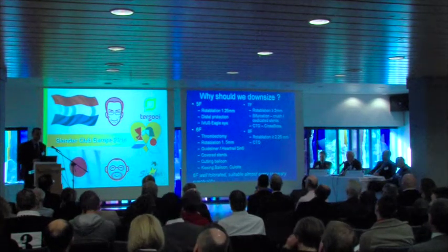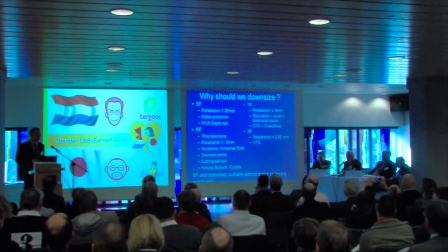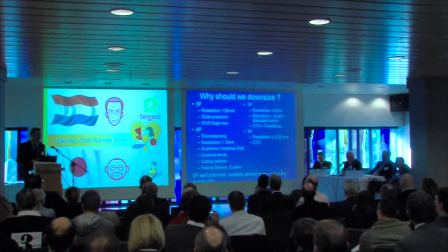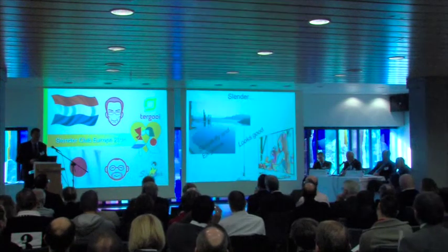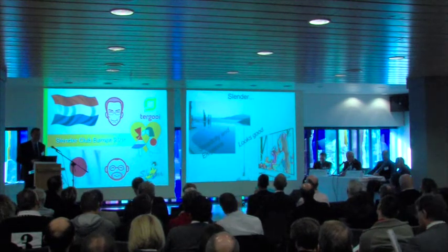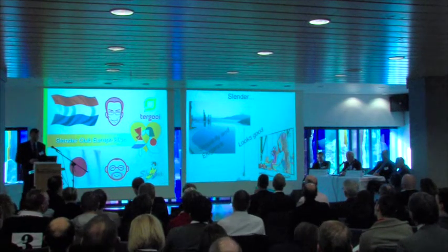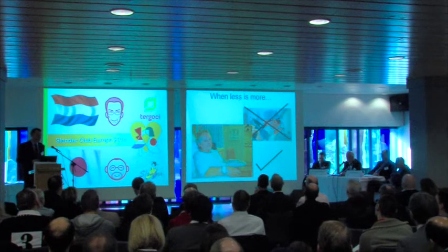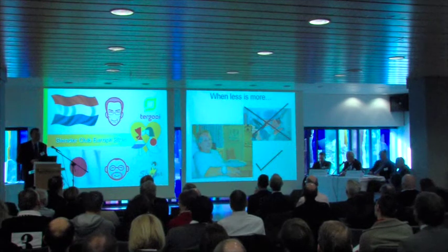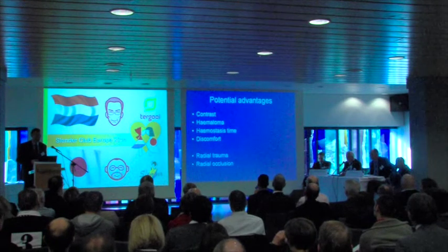6 French, which is the most common catheter size and sheath size, is appropriate for a very wide range of interventions, covers almost everything that we can do nowadays, and in general appears to be relatively well tolerated. What are we talking about in terms of slender techniques? Are we talking simply about elegance and the way things look, or are we talking about different things? Well, of course, we're talking about outcomes for patients, and so I'll be going through some of the reasons why I think we need to do better than 6 French conventional.